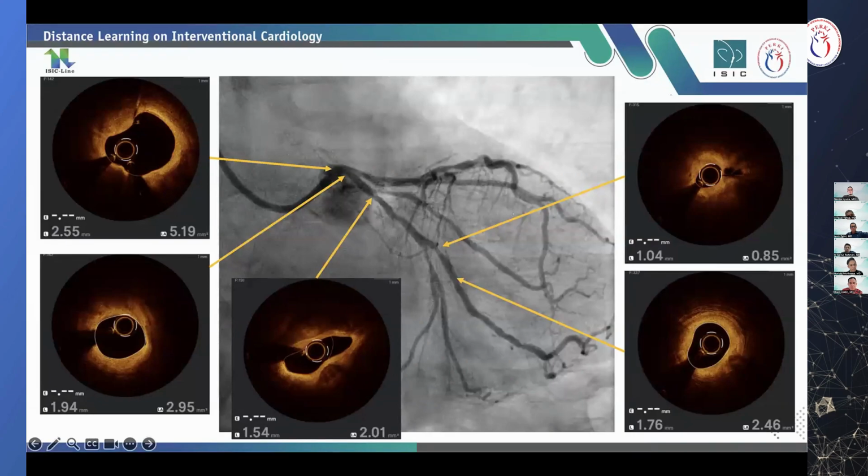It is more in detail. Yeah, we know that, interestingly, the OCT of the circ actually suggested more extensive calcifications than in the LAD. Especially in the proximal segment and a relatively small lumen area in here, for example, is just 0.85 millimeter square. However, the circ ostial diameter here remains reasonably large, I think, with only a minimal disease in here.